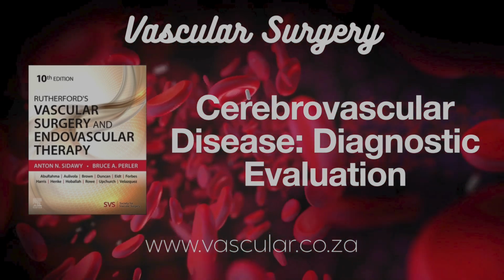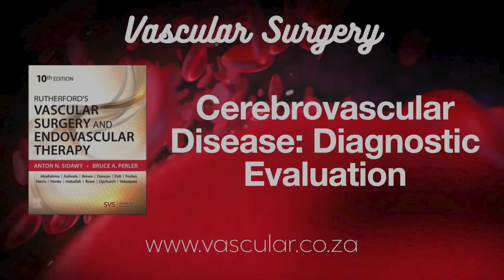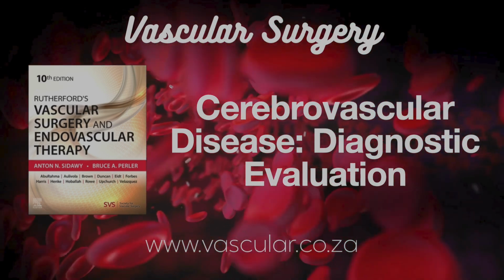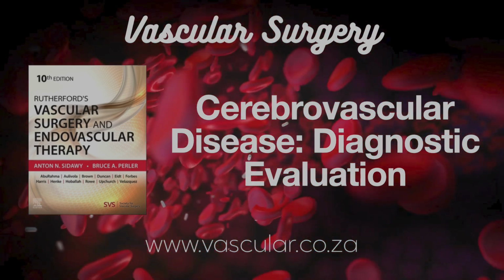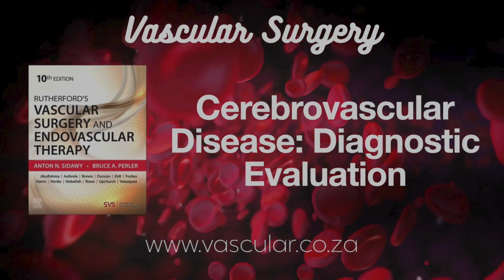Potentially, yes. And the big concern, the main reason for caution with CE-MRA, is that gadolinium contrast. In patients with poor kidney function, there's a risk, albeit rare, of developing a serious condition called nephrogenic systemic fibrosis, or NSF. Right, NSF. That sounds like a major deterrent. Yeah. What about the other type, TOF MRA, time of flight?